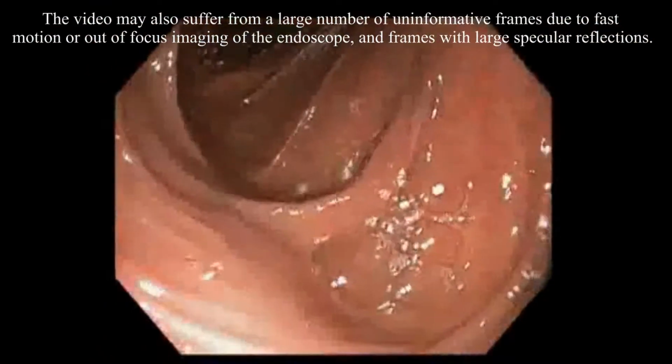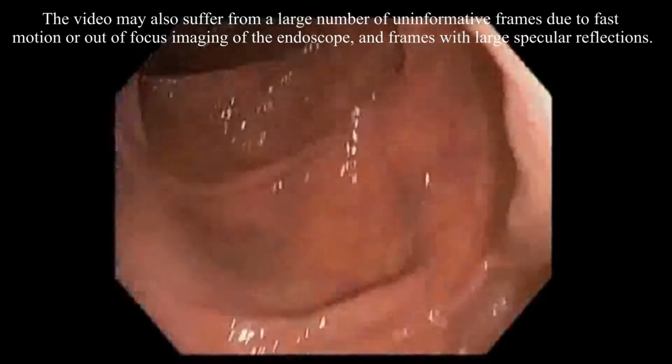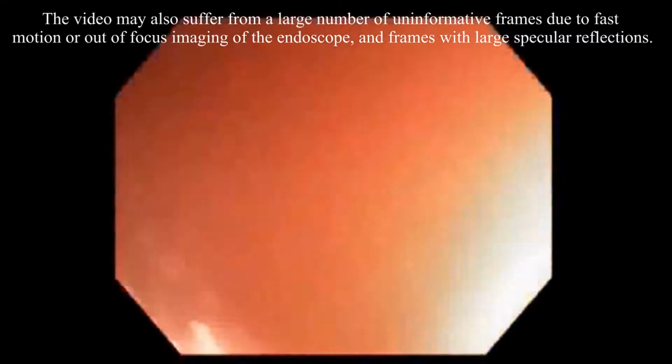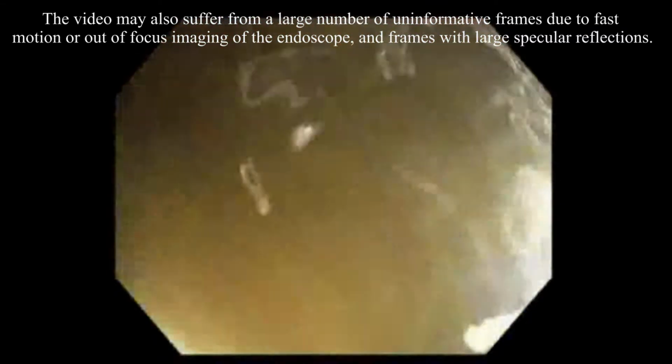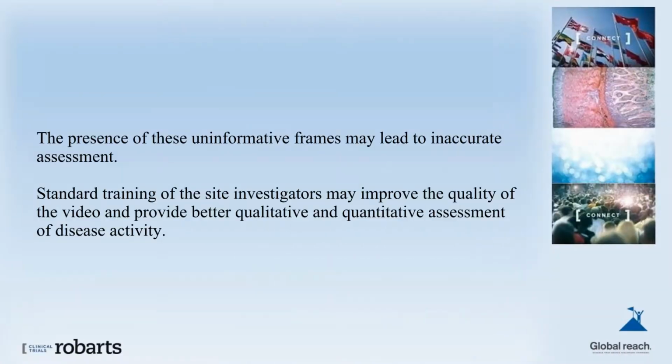The video may also suffer from a large number of uninformative frames, due to fast motion, or out-of-focus imaging of the endoscope, and frames with large specular reflections. The presence of these uninformative frames may lead to inaccurate assessment. Standard training of the site investigators may improve the quality of the video, and provide better qualitative and quantitative assessment of disease activity.